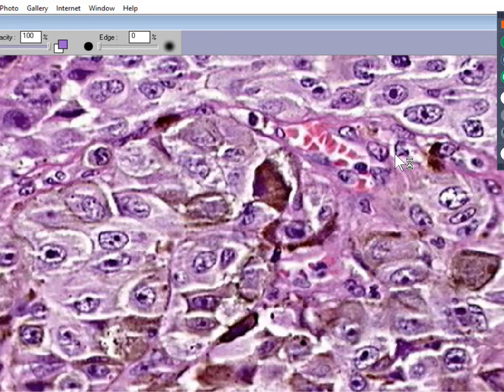Just because you see melanin pigment inside of a cell, could that mean it's a malignant melanoma? No. Why? Because what if there is a skin reaction where the melanocytes undergo apoptosis? Or let's say some of these tumor cells are attacked by some of these immune cells. We don't see too many of them here, but let's say some of these cancer cells are chewed up by lymphocytes. Like maybe you could imagine that might be a lymphocyte, and maybe that is, and maybe that is.